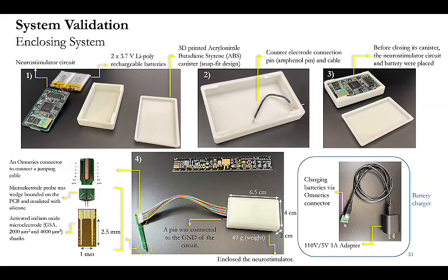I designed a single tiny PCB and assembled it on the Omnetics connector. For example, if the battery is down, you just easily unplug the Omnetics colorful cable, insert the charging PCB, and plug it into a general 110 volt electric outlet for charging. To check the charge status, you can easily see it in real time on the user interface, to make sure that battery charging is done or not.